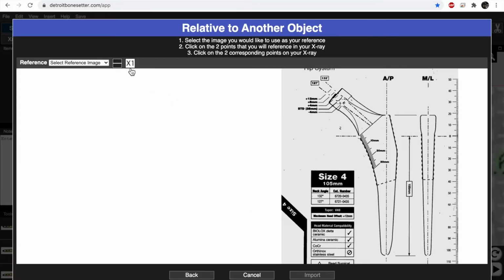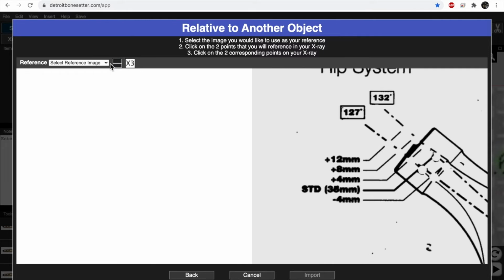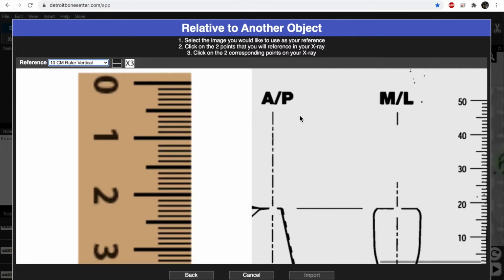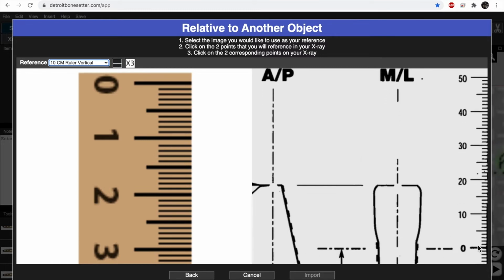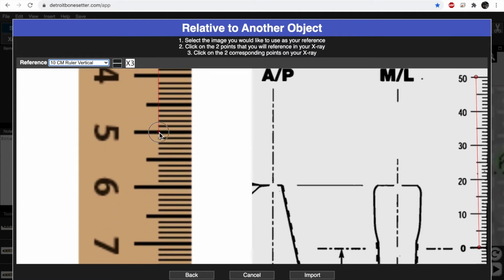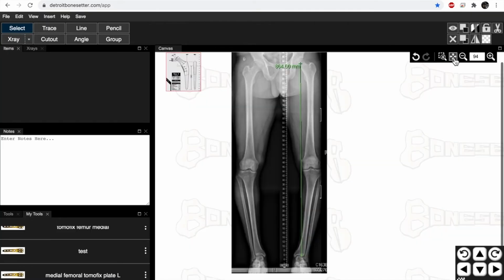So again, I'm going to give it a ruler. So make this big, and I got my vertical ruler, and I'm going to come over here and size it. There's always a ruler on these, and these are magnified on plastic, but they're relatively the same. So I can go 0 to 50, that's 0 to 50, and I'm going to go here 0 to 50. There I go. I'm going to import it. So now this is imported.